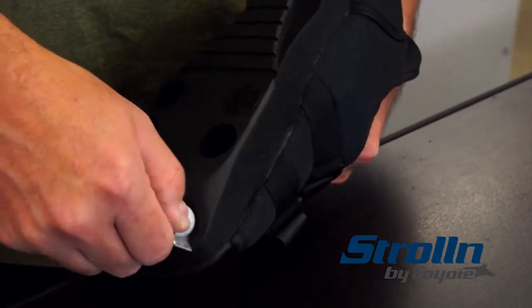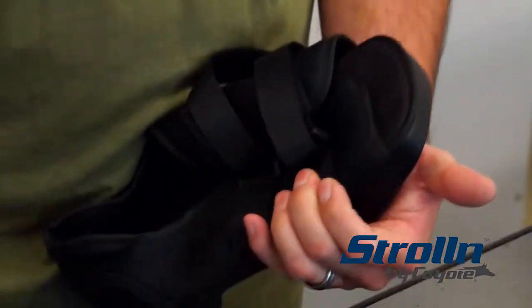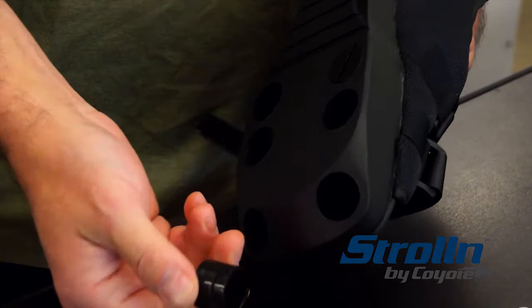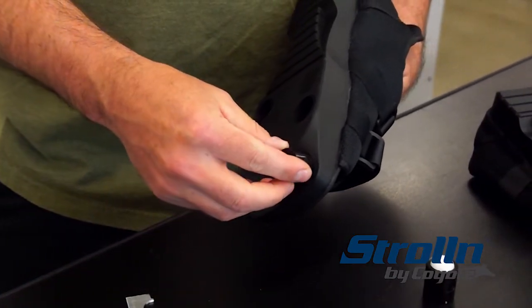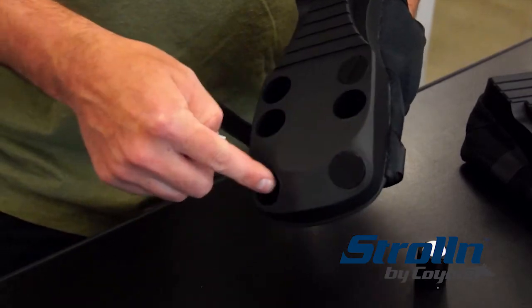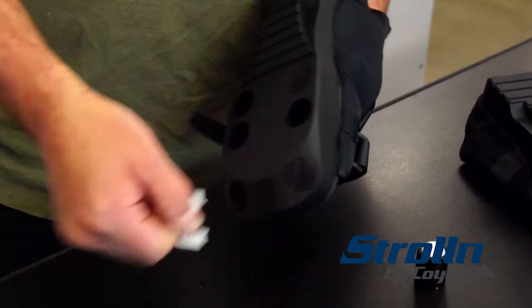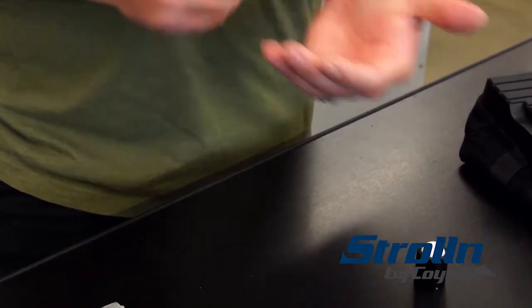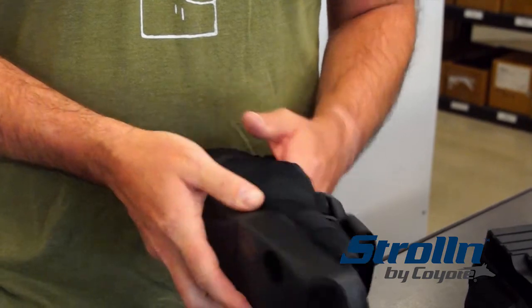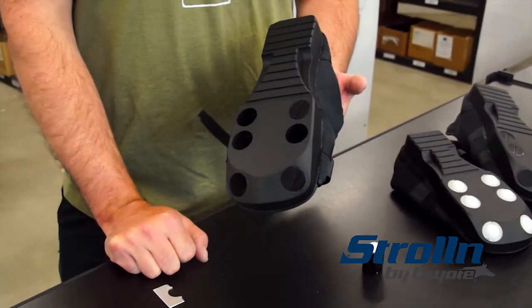Counterclockwise, a quarter turn. Sometimes they just fall right out. Same with putting them in. There are shorter bushings and longer bushings. The toe are the shorter ones. But again, you just got to turn them clockwise to lock them in. Double check that they don't come out. And that's how you replace the retracting balls for plugs if you want.